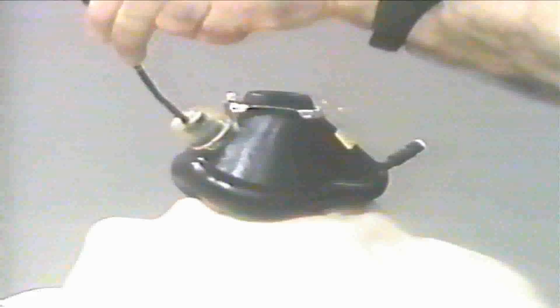The fiber optic is passed through this hole, and while an anesthetist is giving anesthesia, the person who is going to do the fiber optic is passing this fiber optic through this hole until he sees the glottis and passes the fiber optic through the glottis, and the tracheal tube also can be passed through this hole. While the fiber optic is still inside the trachea, the tube is passed through it, and this tube can pass through the mask also and can be taken out through here. A connector is attached here, and ventilation can be continued.